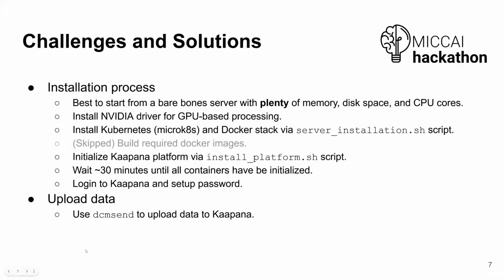Right, so these were our 3 tasks. Now we want to talk a little bit about the process of how we experienced it. So in the first day, we spent quite a bit of time on setting the whole system up. The lesson learned here is basically that you should start from a bare bone server, a fresh install of Ubuntu in our case.